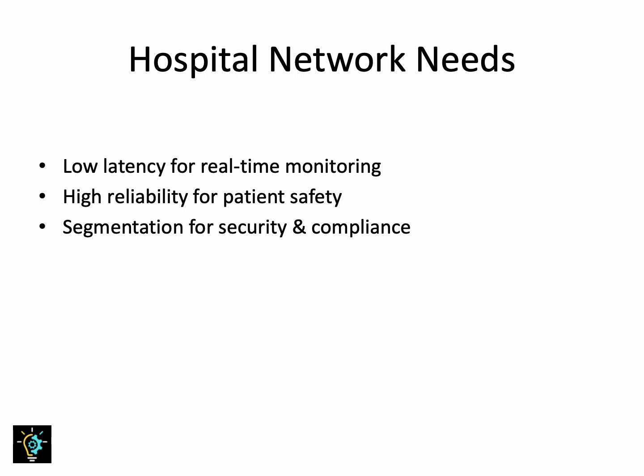Security and compliance add a third layer. Medical networks often need segmentation, which is keeping medical devices separate from administrative computers, for example, to reduce the risk of cyber attacks. All of these requirements shape how the physical and logical geography is designed. So in healthcare, network geography isn't just an IT problem, it's a patient safety issue.